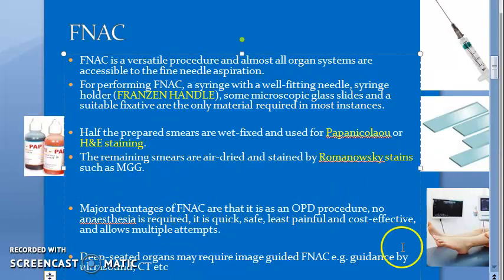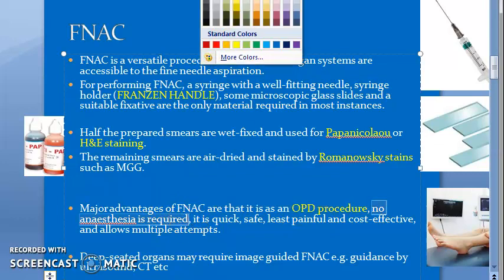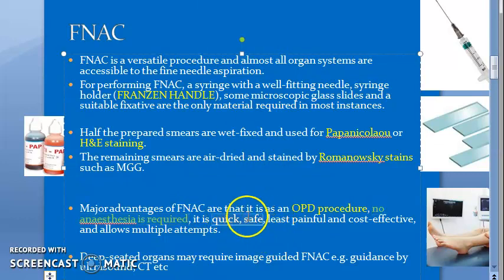Now, what are the advantages of FNAC? It is an OPD procedure. Nice. No need to admit the patient. No anesthesia is required. It is quick. It is safe. It is least painful and cost effective. Least painful. They didn't say painless. They said least painful, which is more relatable. If they say painless, I really don't believe them. So least painful is better. It is cost effective, and that's also a nice thing, right?